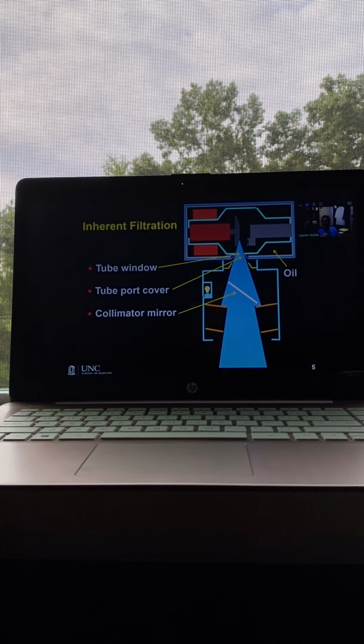Okay, and what do you think would happen? What do you think you would end up seeing on your image? Every image would have a light bulb in the middle. It would look like the patient swallowed a light bulb. Exactly. So it has to be off to the side.